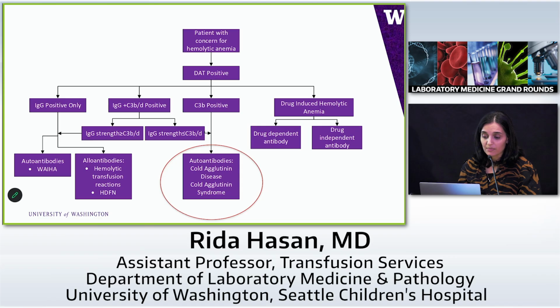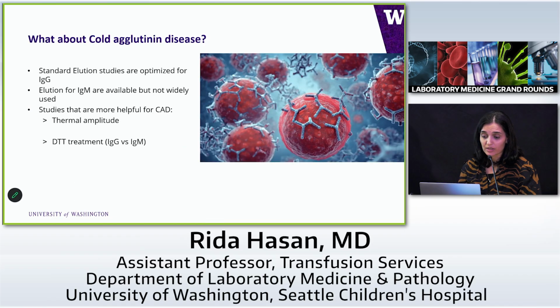And then the other thing is that maybe it's not a false positive. Maybe it is a true positive, but the patient has a cold antibody, because when we do the elution that we run in our blood bank, our standard elution techniques are optimized really for IgGs.